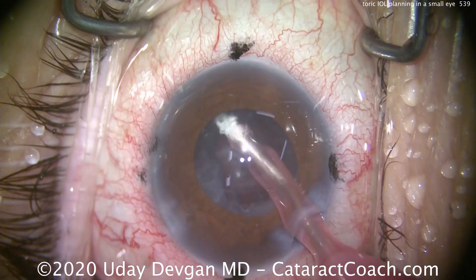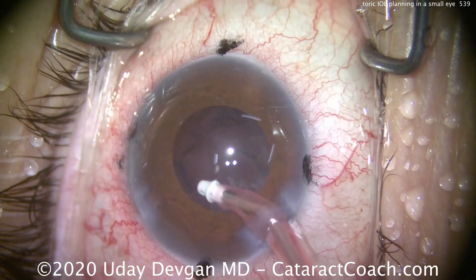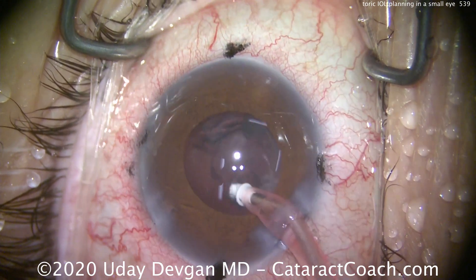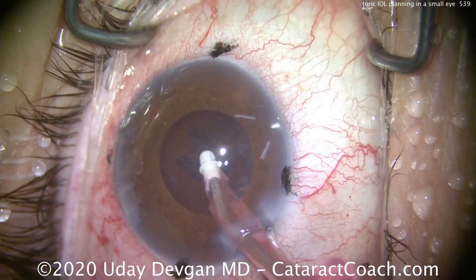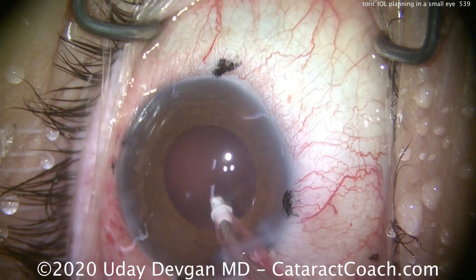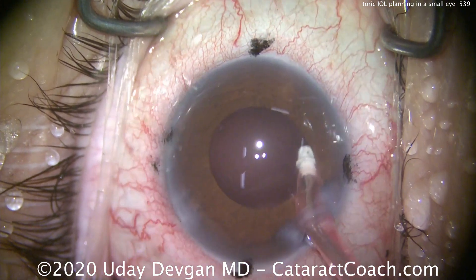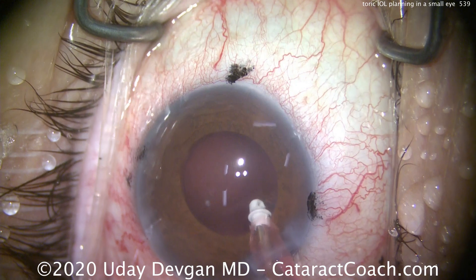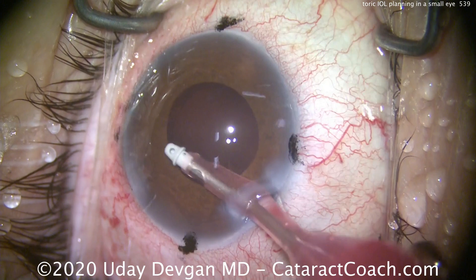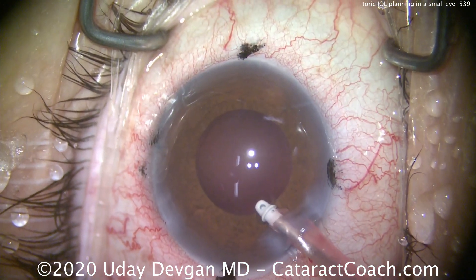The marks on the toric IOL are at about the 5mm zone. It's a 6mm optic and you have those toric marks, so as long as we have about a 5mm pupil we should be able to easily see our marks on the toric lens — and that's going to help with alignment. Alignment here is critical. We are showing you the whole case start to finish; I know it's an investment of eight minutes, but it's well worth it, especially if you're just starting off using toric lenses.